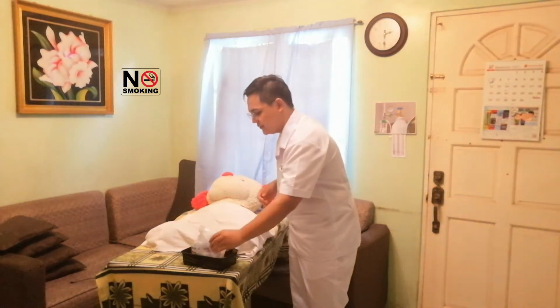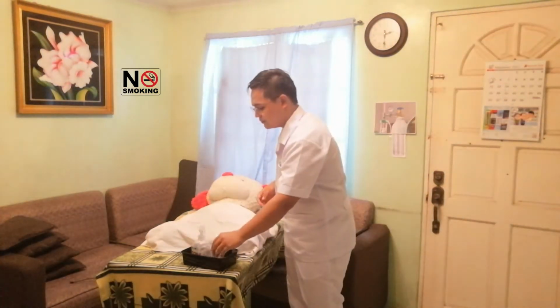And after that we will need to go to our next step, which is our planning phase. We need to assemble our equipment. We do need to have an oxygen supply with flow meter and adapter, and also we need a humidifier with instilled water or tap water, according to the agency protocol. And also we do need to have a nasal cannula and tubing. So here it is. Okay.